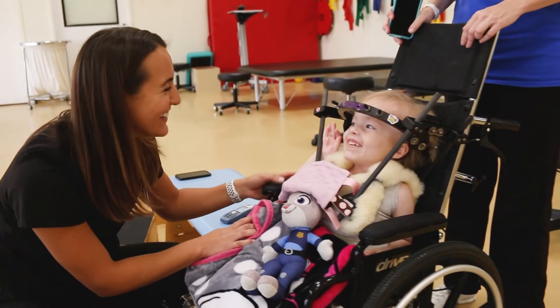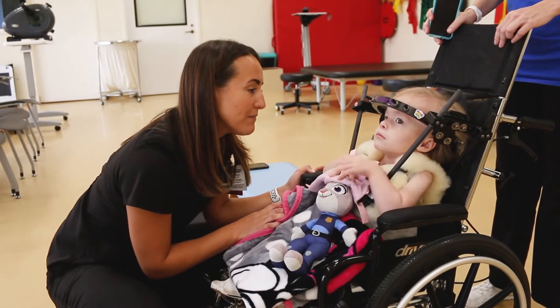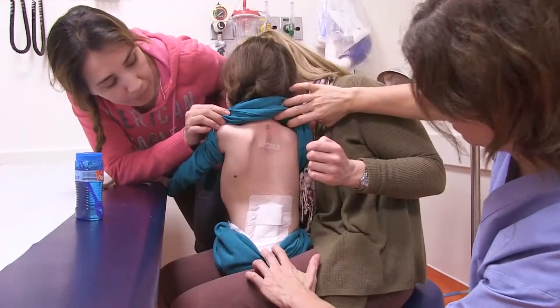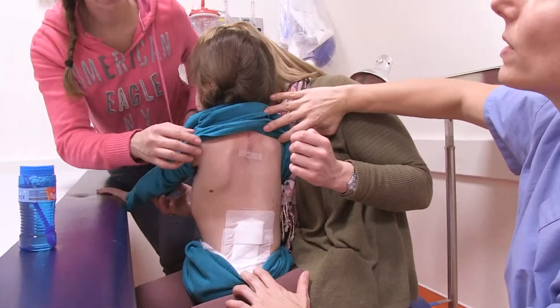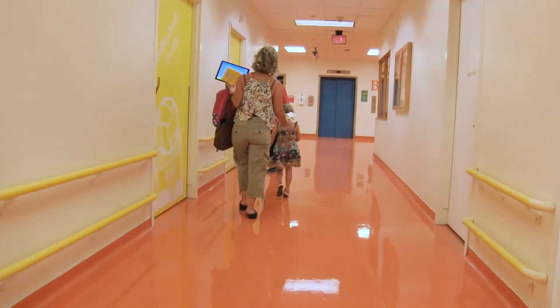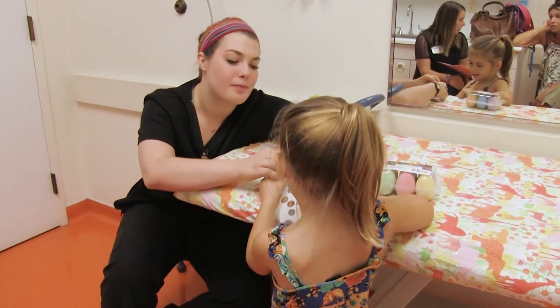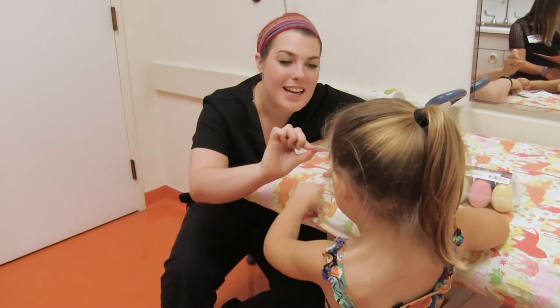After surgery, they're in the hospital for probably anywhere between 4 to 7 days. They need to heal where we placed those hooks or screws for about 4 to 6 months. But then after that, we'll usually have them come back on a scheduled basis to clinic, usually every 3 to 4 months, where we basically just put this machine on their back, push a button, and then we can grow their spine by the magnet technology.